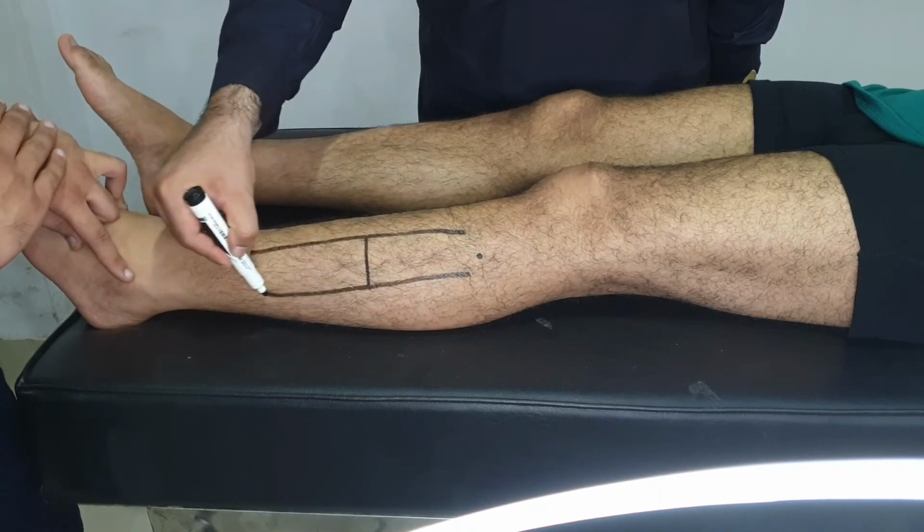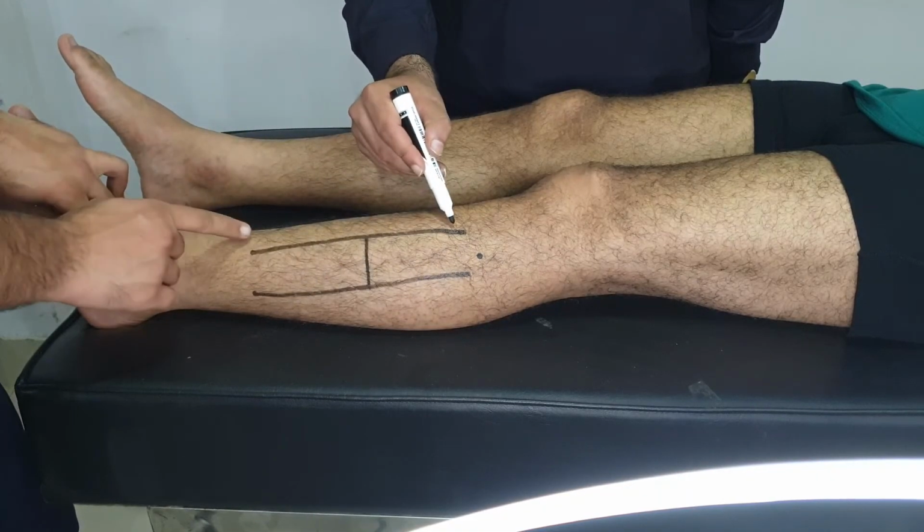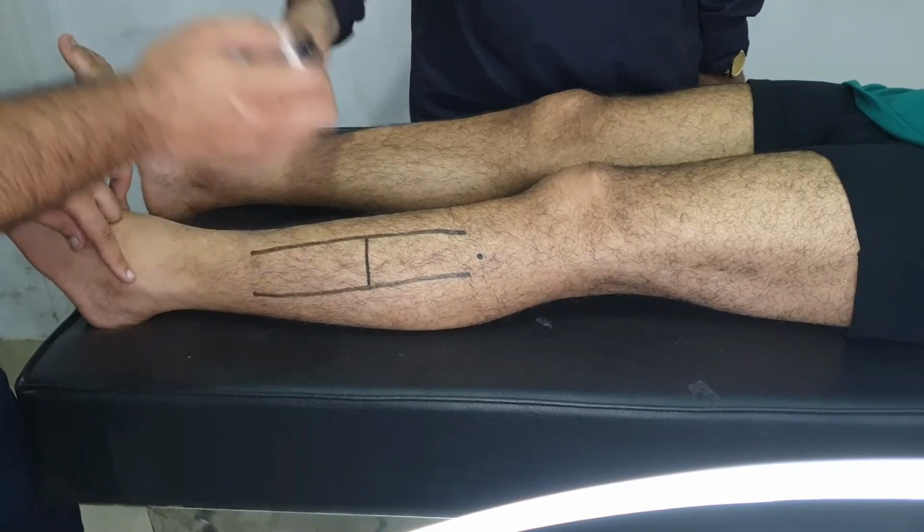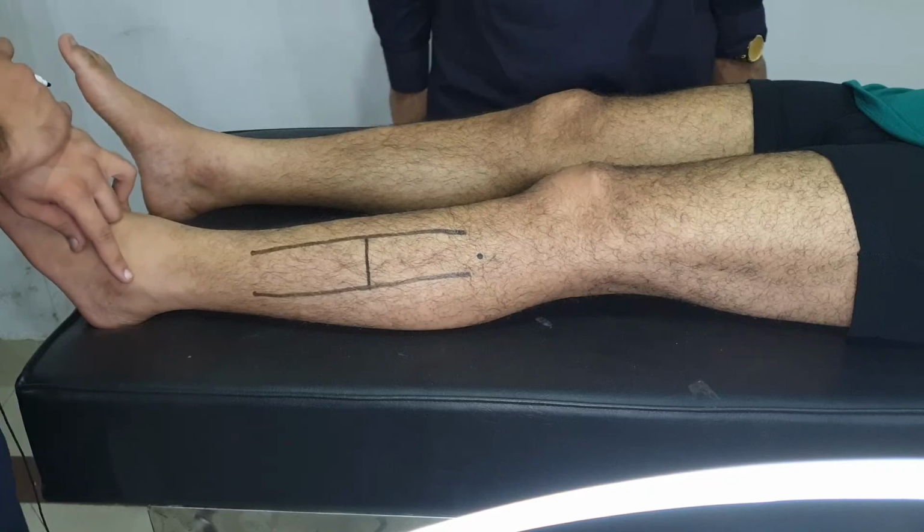Exactly. So one limb of the H is on the anterior compartment and the other limb is on the lateral compartment. Yes sir. And we will incise the fascia. It will be completed. Exactly sir.